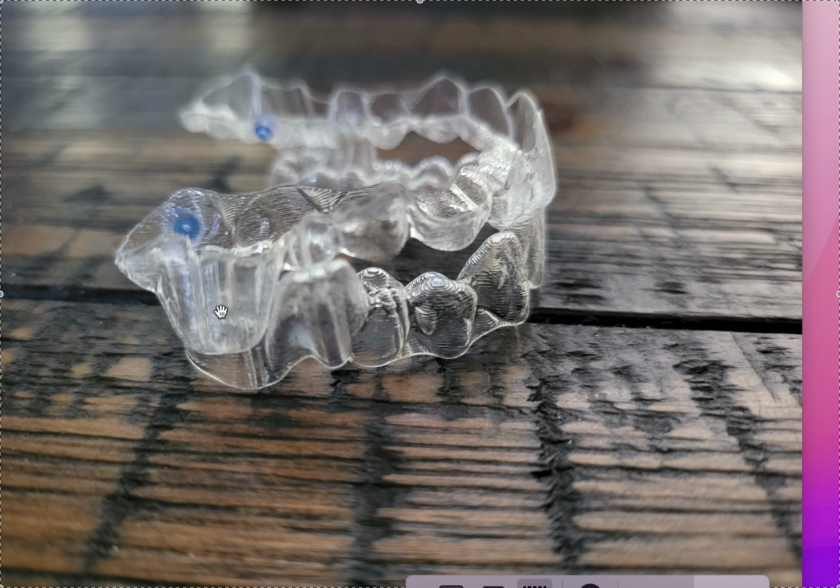And you don't have to wear necessarily elastics. I'm not promising you there's not going to be elastics. You might need to use them on the refinement, sometimes just to fine tune things or just to balance things out a little bit, or if we didn't quite get there, that'll help at the end. But the majority of the growth will happen from the MA, and it works really well. I've seen tons of cases completed, and people were really blown away at the incredible improvement.